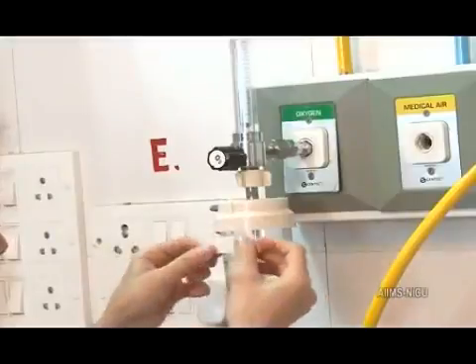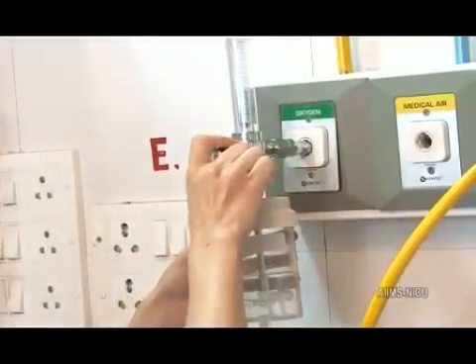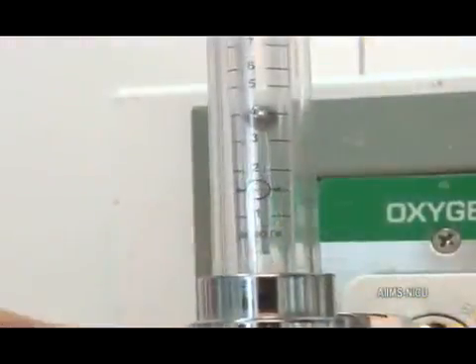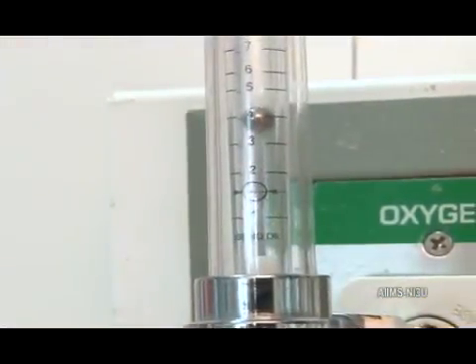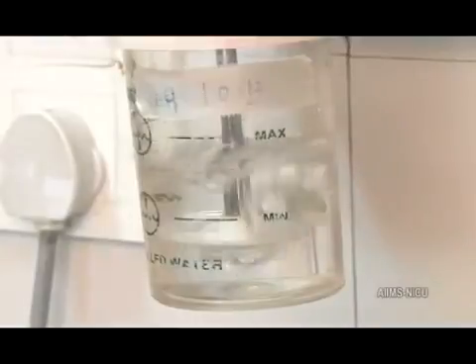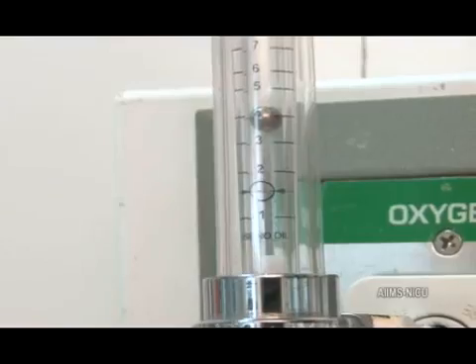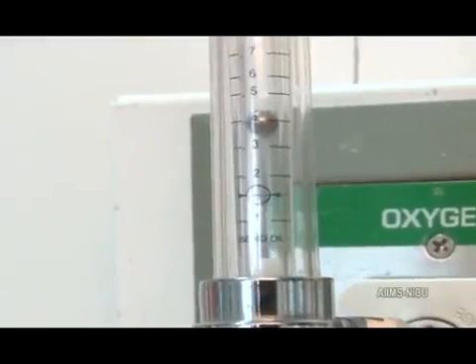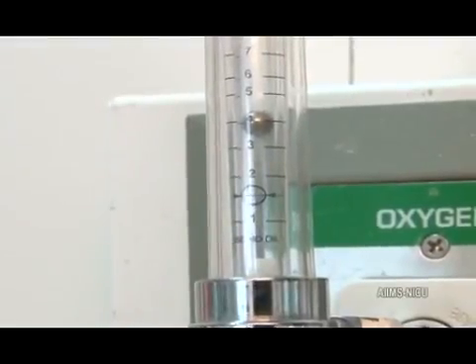Set the flow rate. Here, we shall learn about the administration of oxygen by hood. The flow rate is set at 3 to 5 liters per minute. Observe if the bubbles are coming out in the humidification chamber. Remember, the flow rate should generally not be less than 2 liters per minute while administering oxygen by hood.